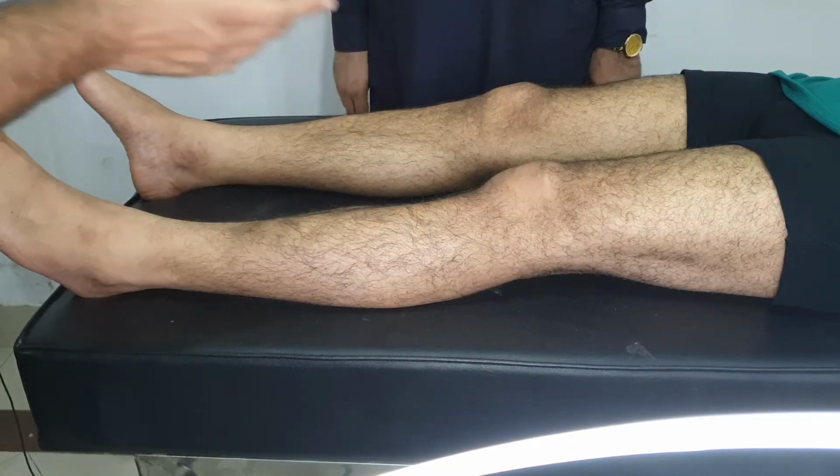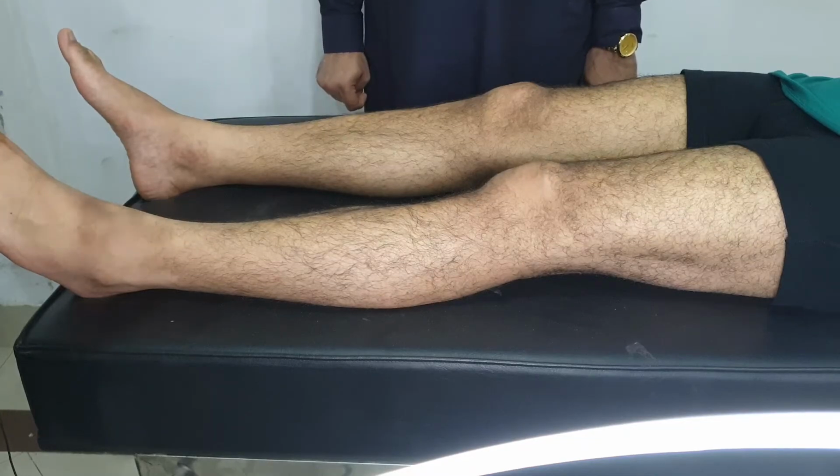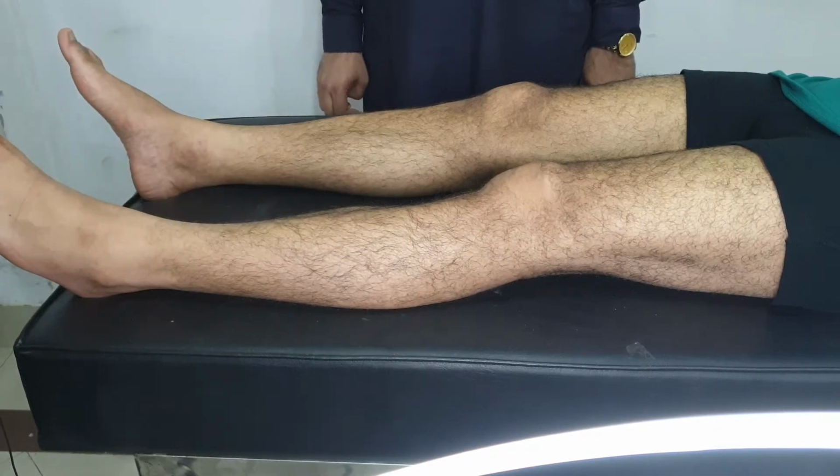Sir, for the confirmation of compartment syndrome, we have multiple options. The most commonly used method is the handheld Stryker machine, which we use to measure the intracompartmental pressure. Sir, if the intracompartmental pressure is 30 or more than 30 mm of mercury, this is most probably compartment syndrome.